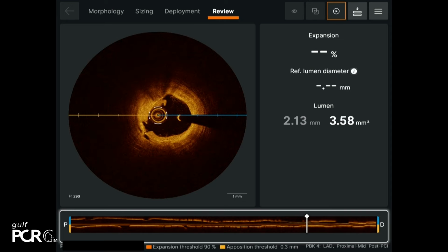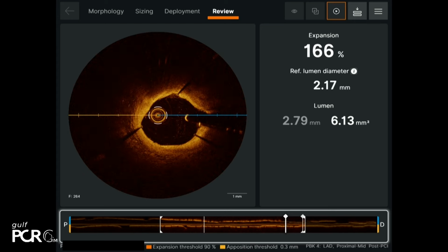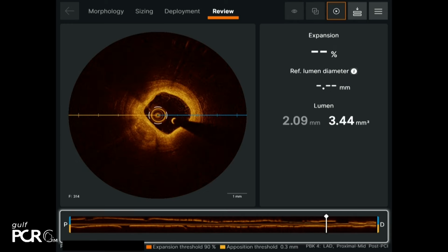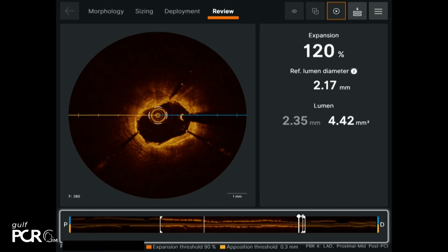There's some there. Comment from Dr. Ali, I'm inclined to leave it alone. Hi, Dr. Khalid. I think distally there's a thick calcium. If you look at the distal in the OCT, there's a thick calcified plaque from 8 o'clock to 12 o'clock. Just come back a little bit with the OCT, a little bit more, into the stent. More. We're not in the stented area yet. There's a little edge dissection here. Yeah, you see it at 11 o'clock.